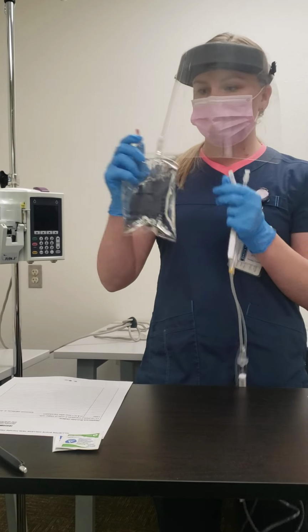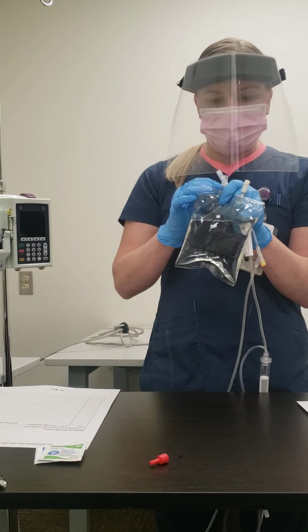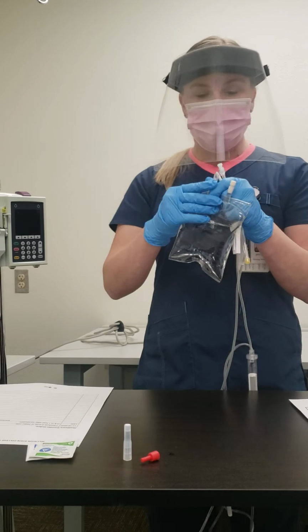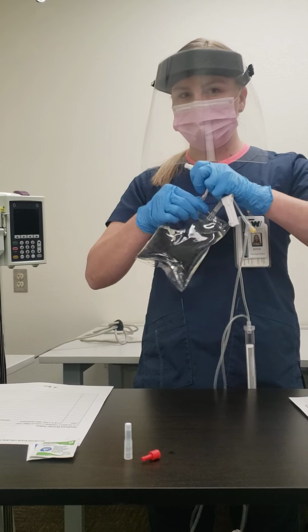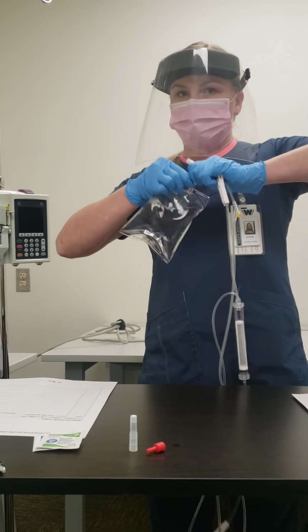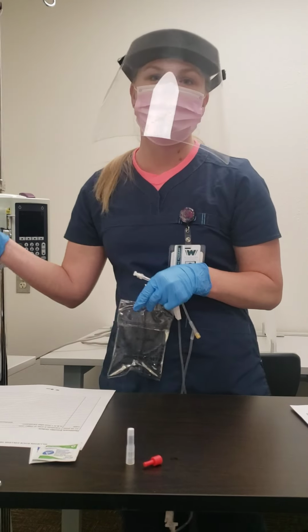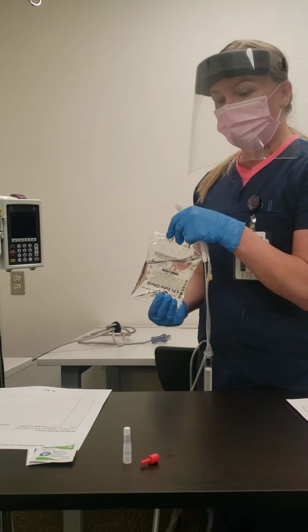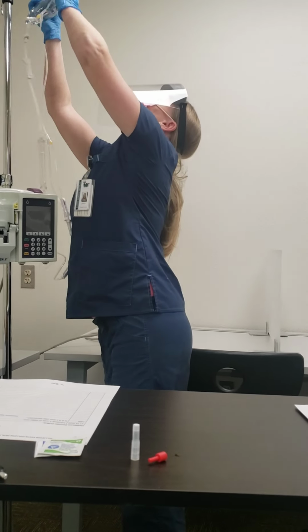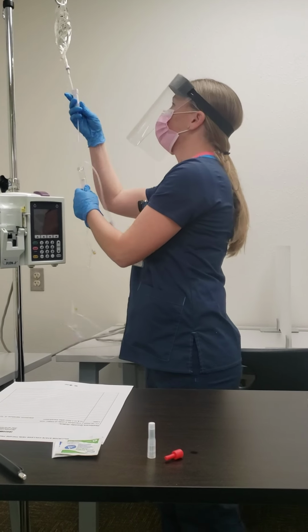Okay, we would do the med checks normally, but for the sake of the video, we're not going to do those. So we'll just pretend like we did all 3. Oh yes, and I also gathered vital signs from my client before, just to get a baseline vitals for them before blood administration. So now I'll just go ahead and prime this.